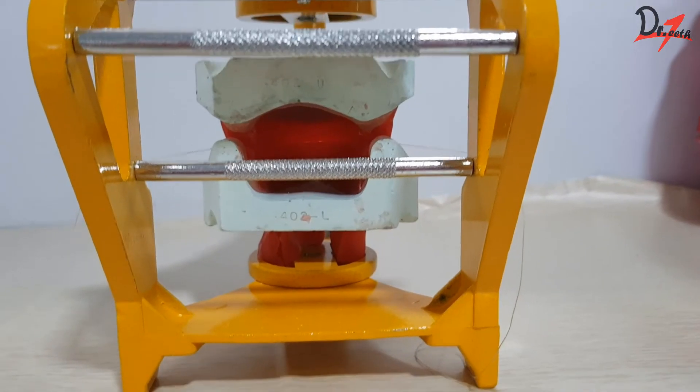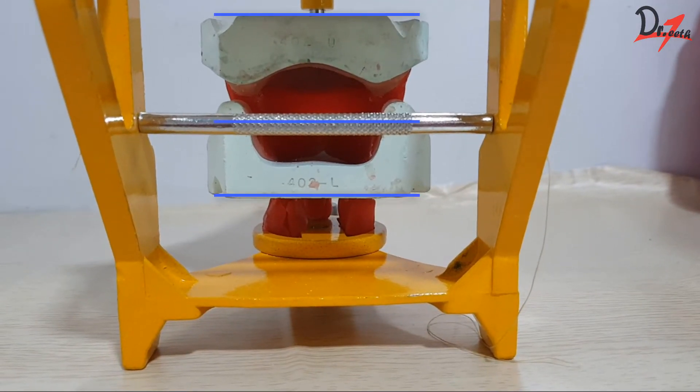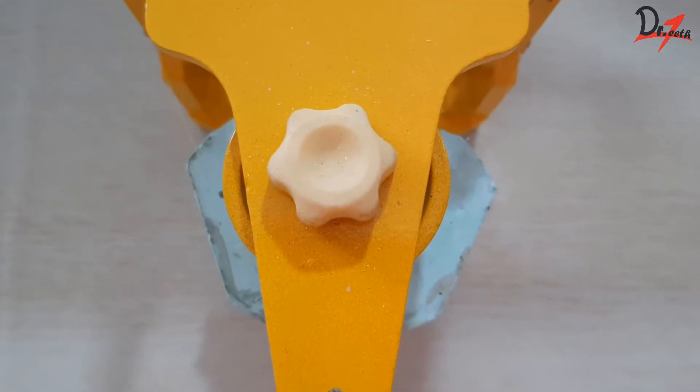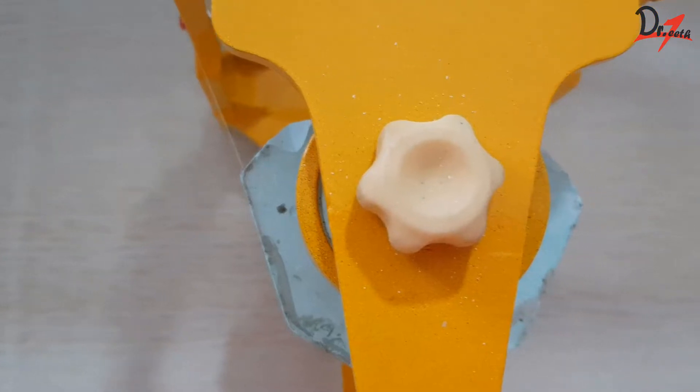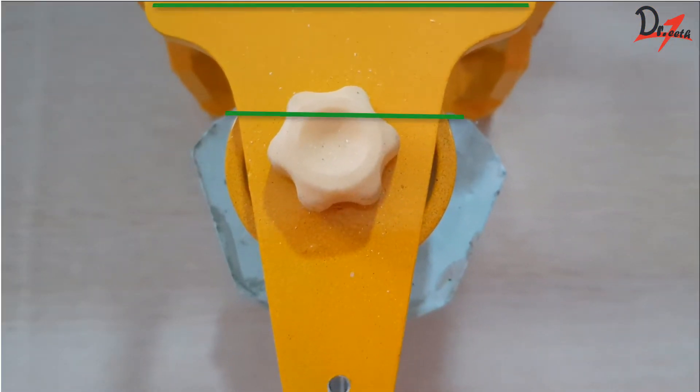From the posterior side, we have to make sure that the casts are parallel to the reference rod. As you can see here. From the superior view also, we have to check if the cast is parallel to the upper member.